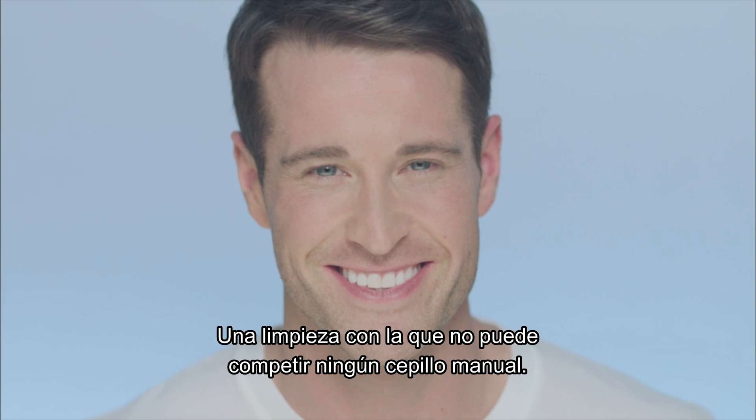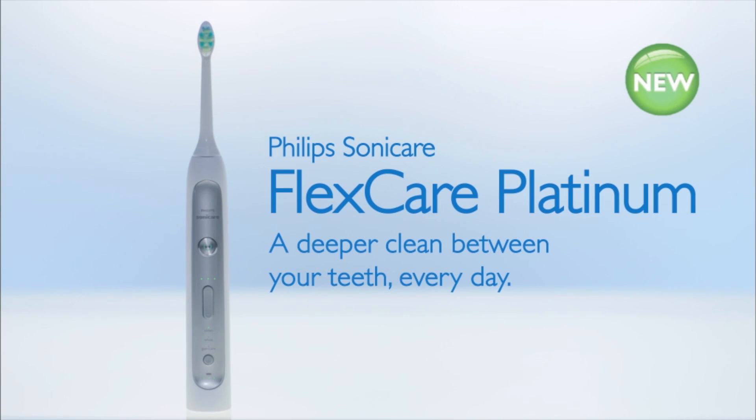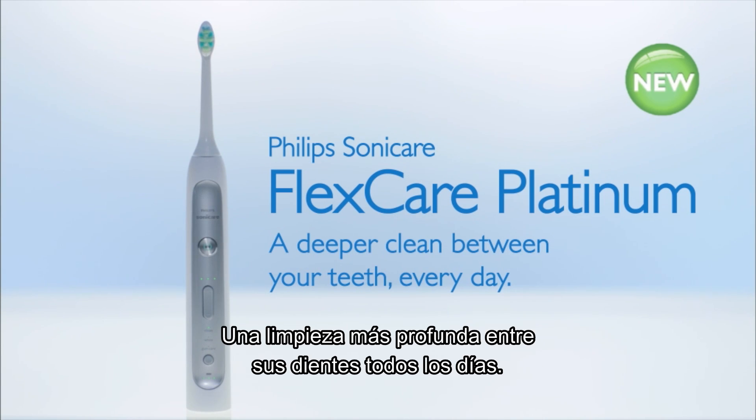A clean no manual toothbrush can compete with. New Philips Sonicare FlexCare Platinum, a deeper clean between your teeth every day.